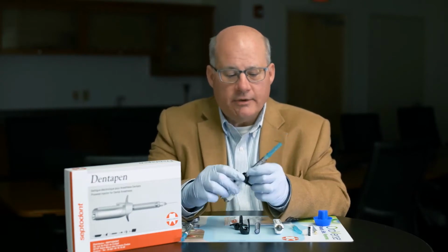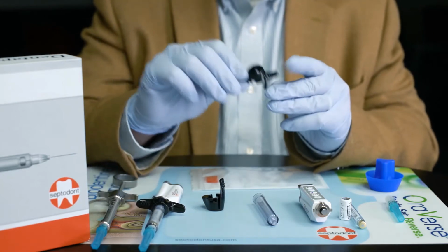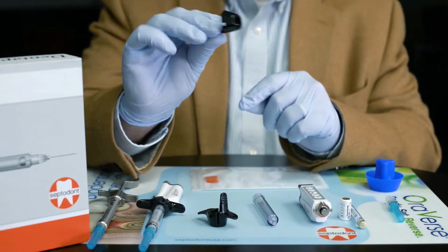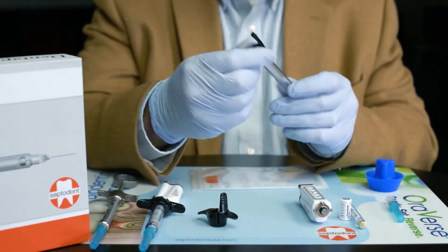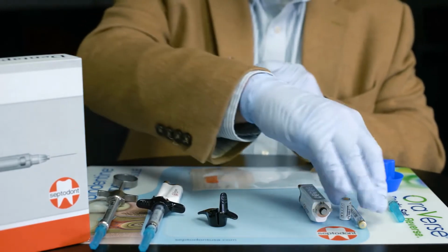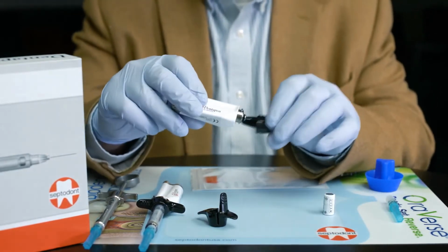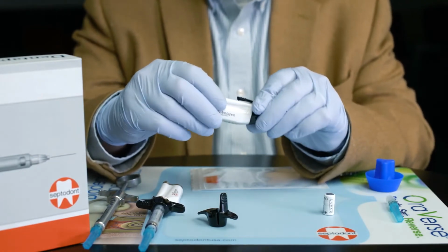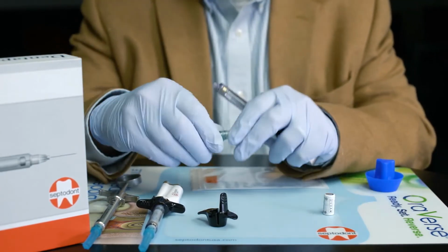Now, the Dentapen is very simple to assemble. Start with the finger grips. There are two styles, the syringe style and the pen style. Next, take the cartridge holder, insert it into the finger grip. Take your cartridge of anesthetic, and to attach, align the knob with the grooves. Push and turn. Your next step is to put a needle on.